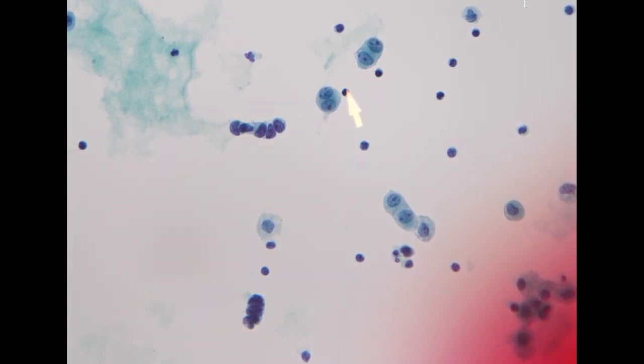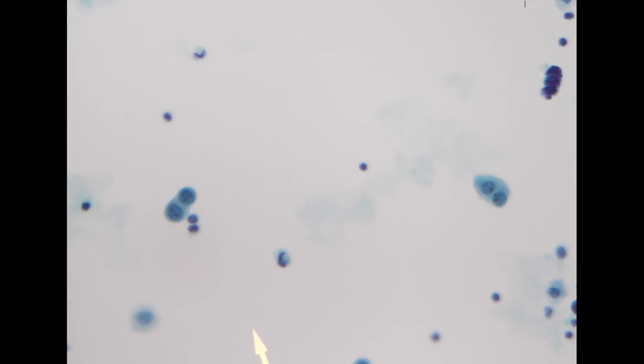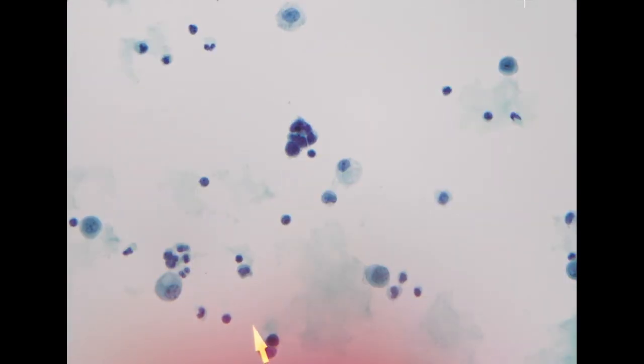This is mesothelial cells. So you see these relatively small cells, because they have the same size of nucleus as the mesothelial cell, but with a very high N/C ratio. The chromatin pattern is granular, finely granular, and this is the Indian file arrangement with nuclear molding. So again, here we see the Indian file with molding. Sometimes you will also see this molding pattern.